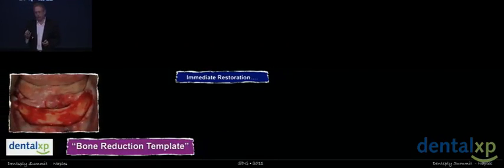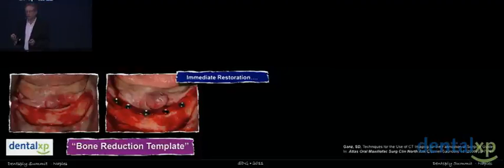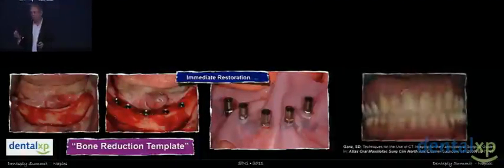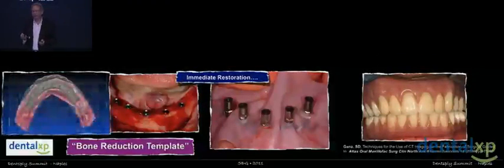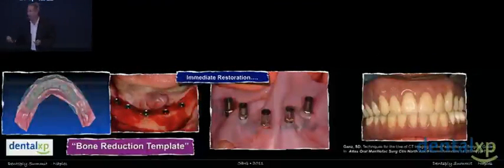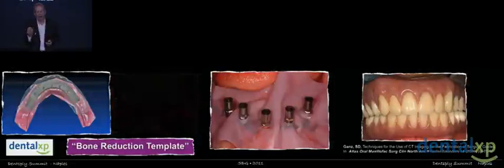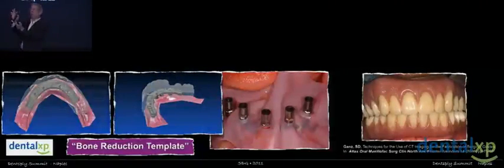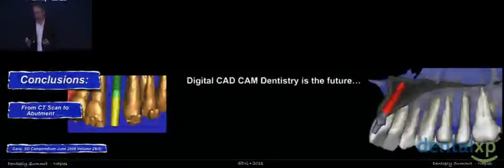And the immediate restoration for this particular case, we actually did. We put these implants into an immediate load situation. This was published back in 2006. It's 5 years ago. And then, of course, we have other technology that was already mentioned: CAD/CAM technology to create the bars, to create the metal substructures. We need to be able to put implants in parallel to make our life so much easier. Looking at all implants going at different angles is not what my laboratory technician wants to see.